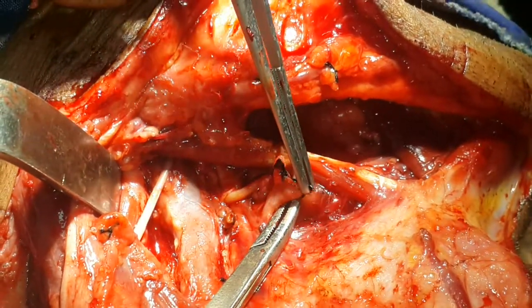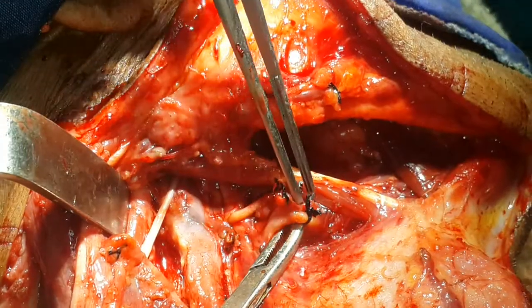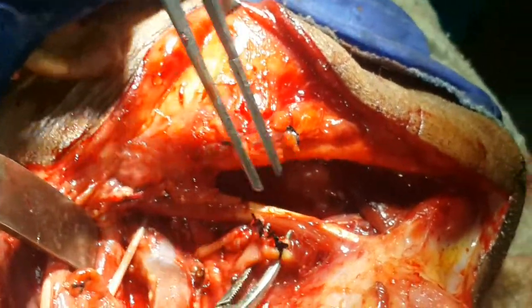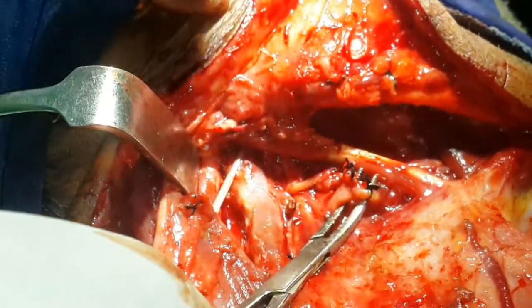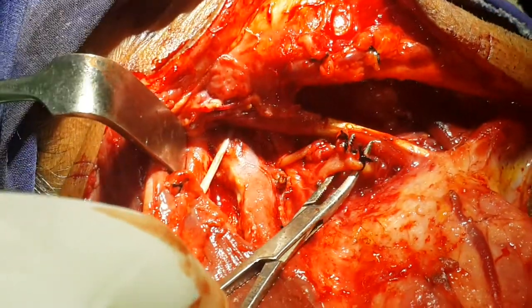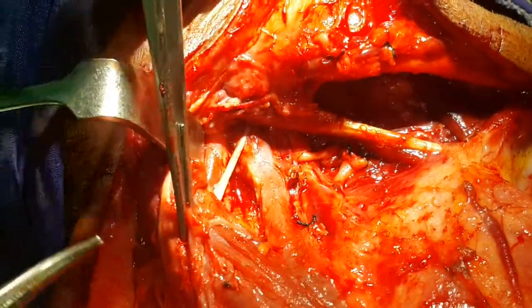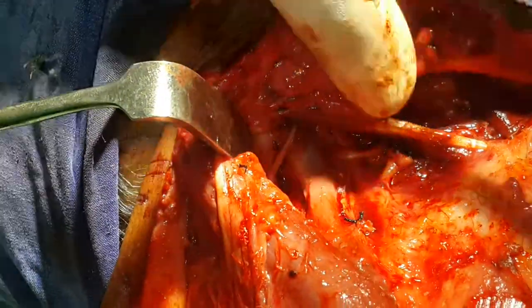You just put a ligature and tie. It need not excise the whole artery — just put a ligature to reduce the blood supply to the tongue. So this will help you dealing with the hemiglosectomy.